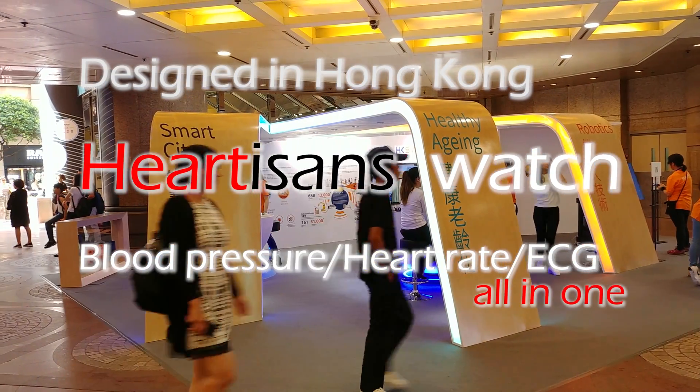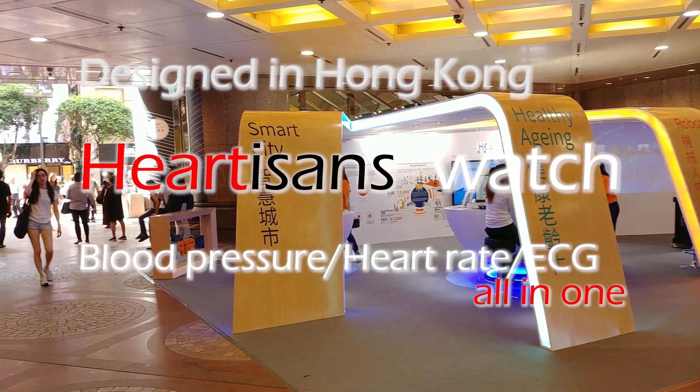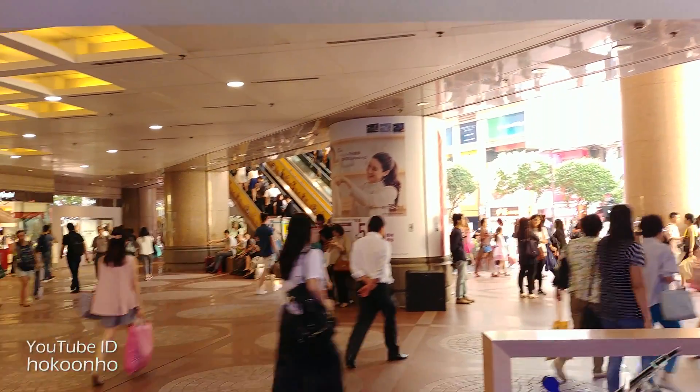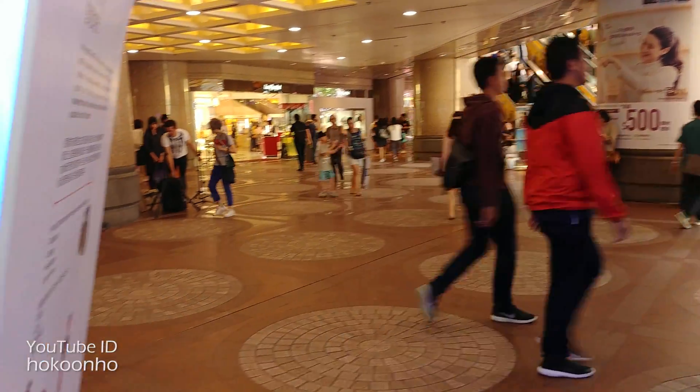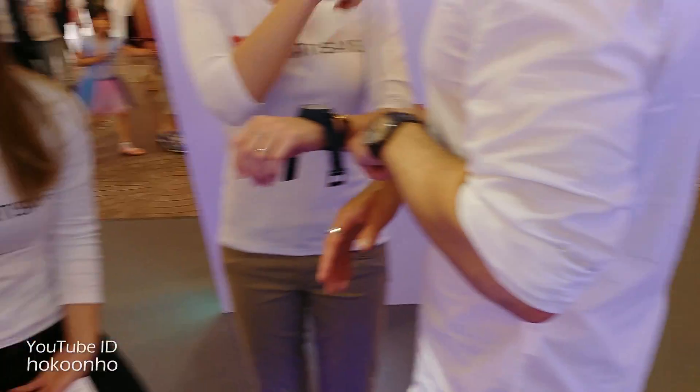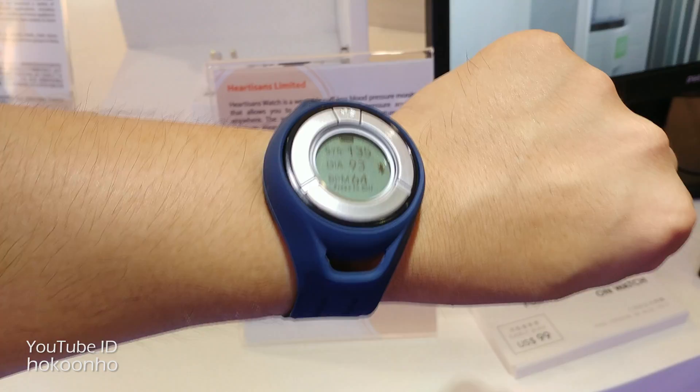Hello everybody, today I'm pretty excited. I'm in Times Square at Causeway Bay, and I'm going to take a look at the latest Hardison watch, which measures the blood pressure, heart rate, as well as the ECG.